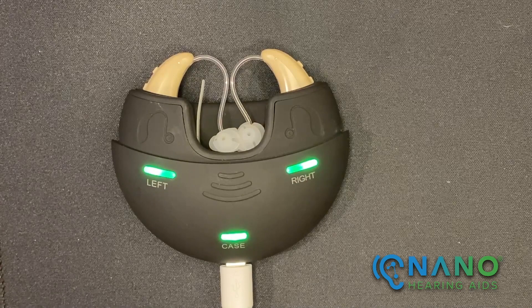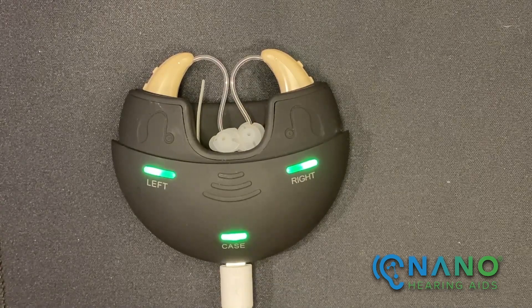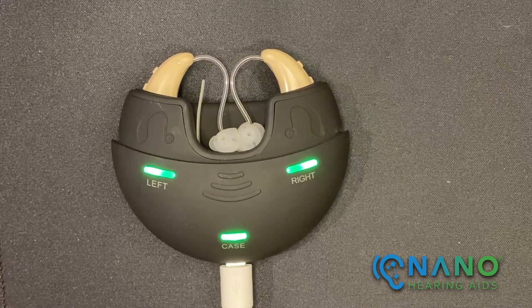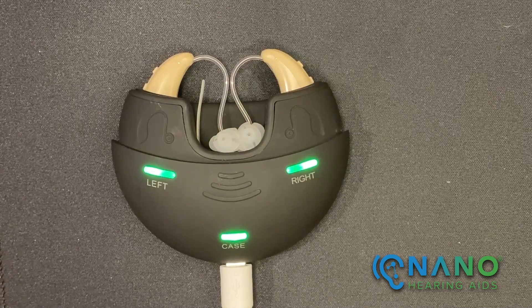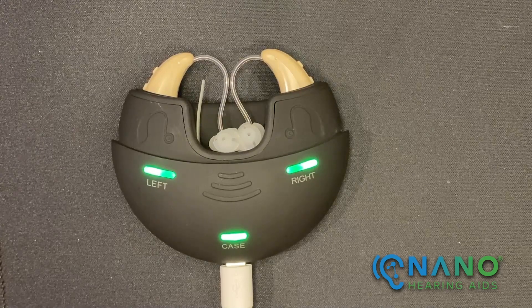Once the charging case indicator light is green, it can charge the hearing aids without being connected to power. In fact, a fully charged charging case can provide three cycles of charging without being connected to power.